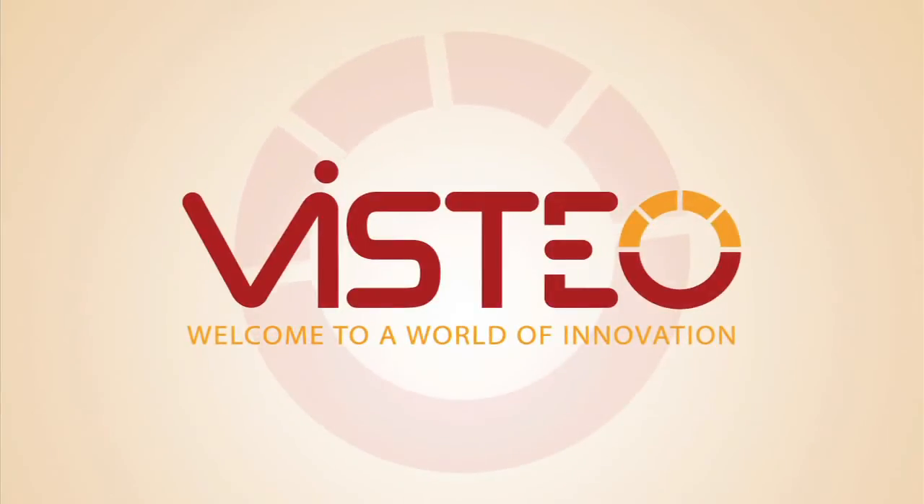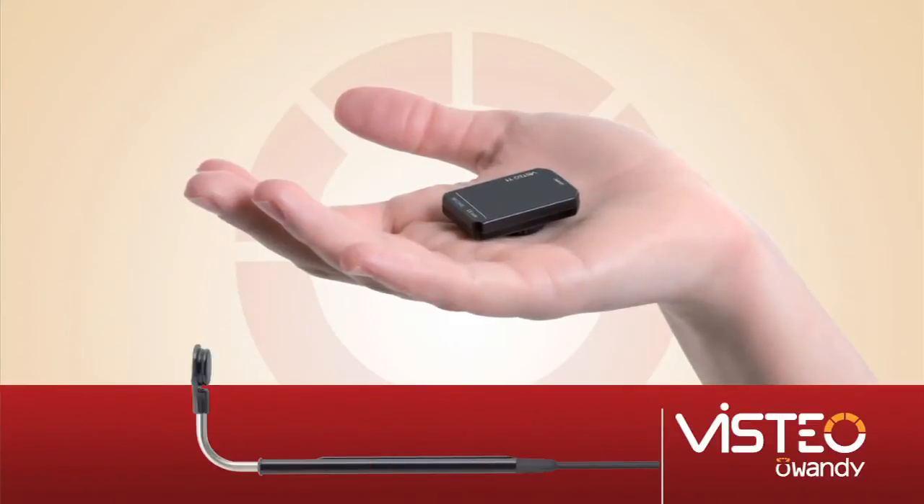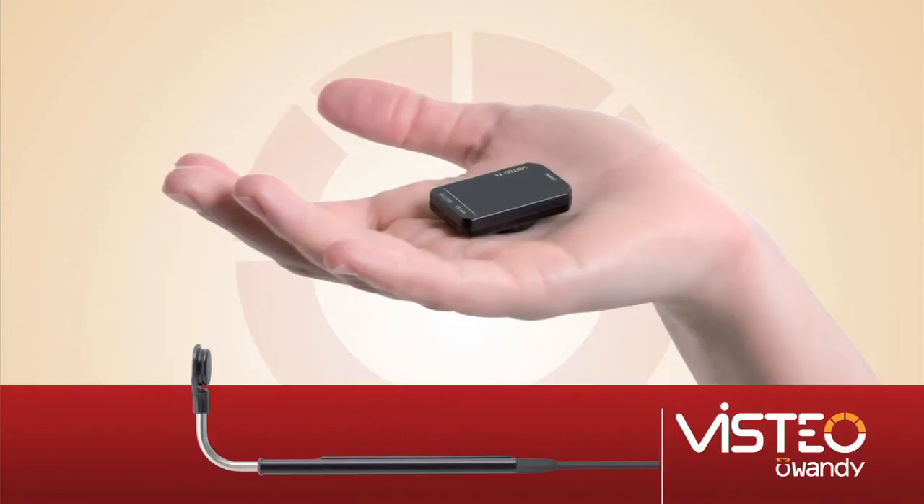Vistio uses a new, innovative technology called induction, which allows us to combine all of the benefits of all other sensors on the market into one single product.